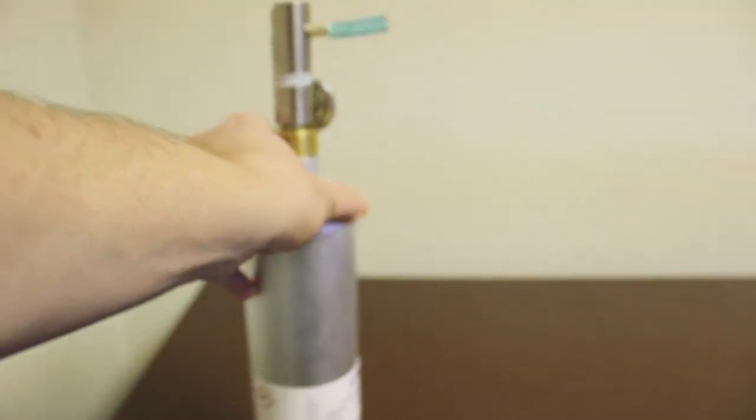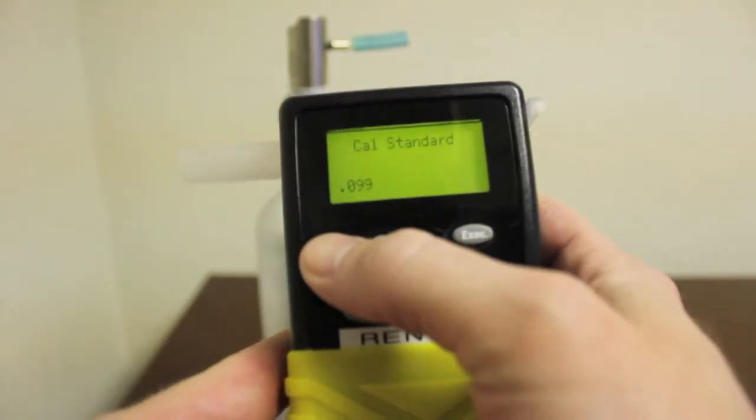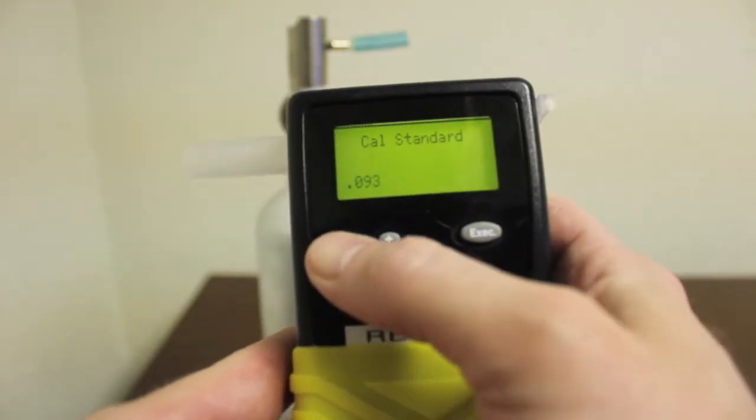Because we're at elevation, we need to use the altitude correction factor table on the bottom of the dry gas tank. We're at 5000 feet, so we take our value of 0.820 and multiply it by our 0.100 gas standard, giving us a result of 0.082.